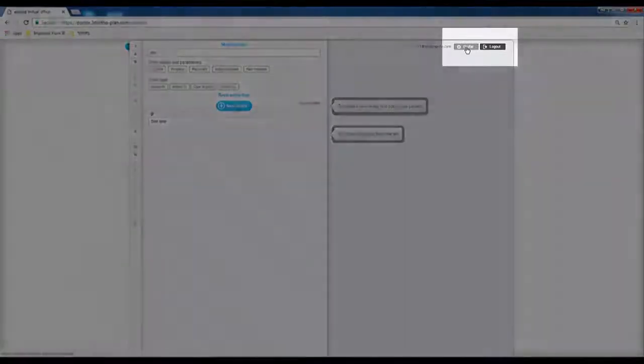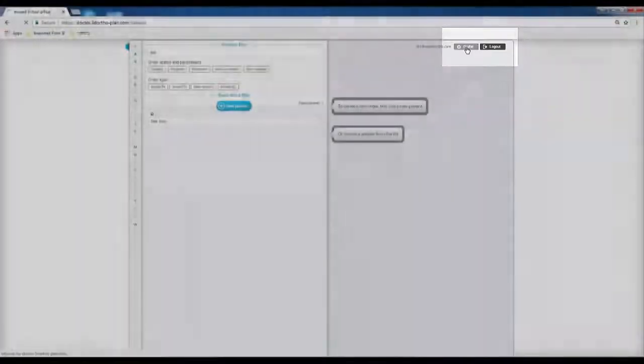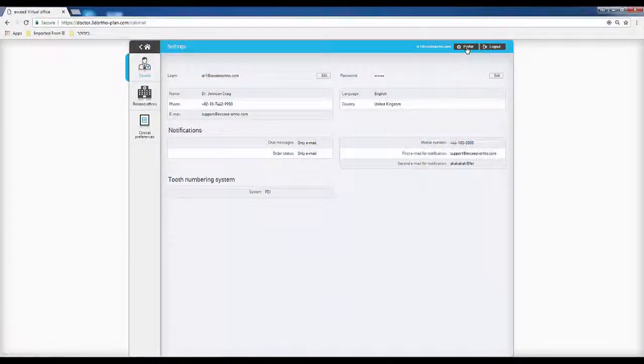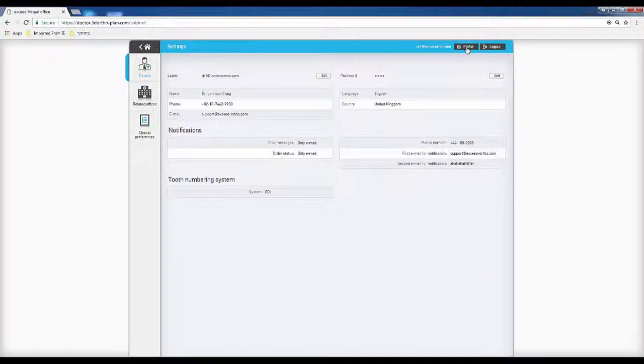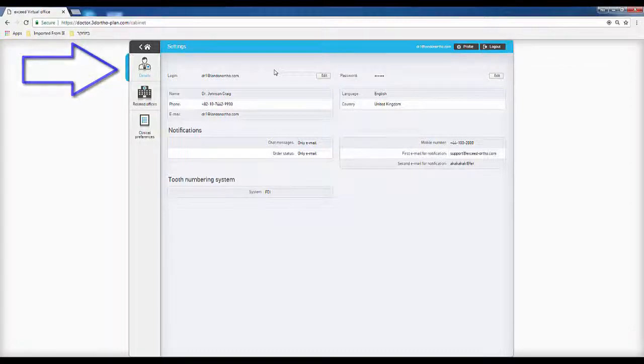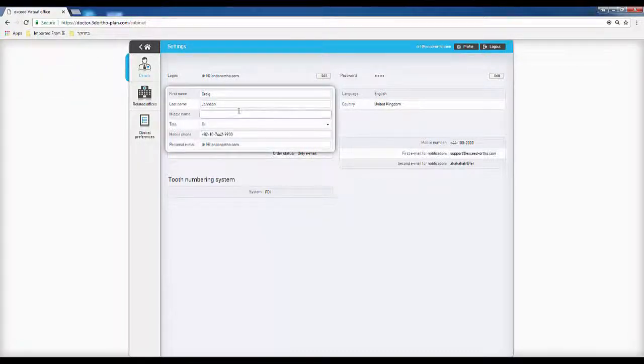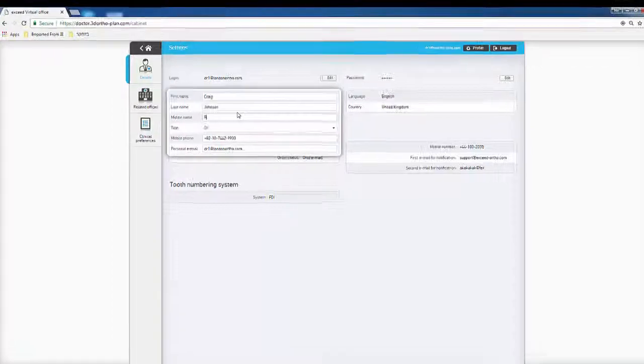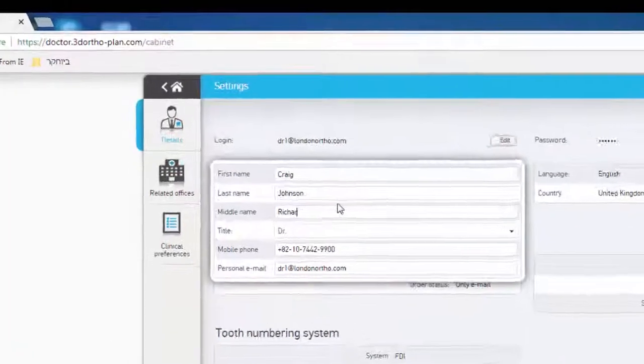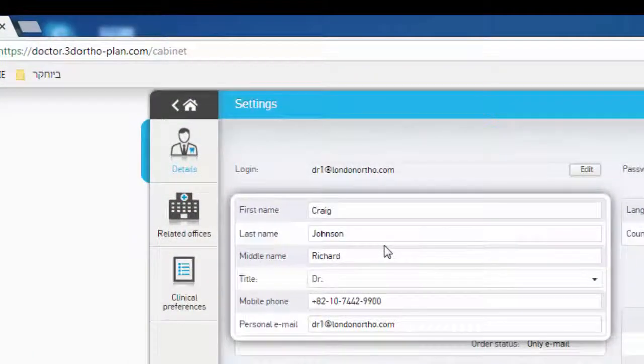For first-time users, it is recommended to visit the profile area. The Details page contains doctor's information and communication details. If necessary, double-click to edit.